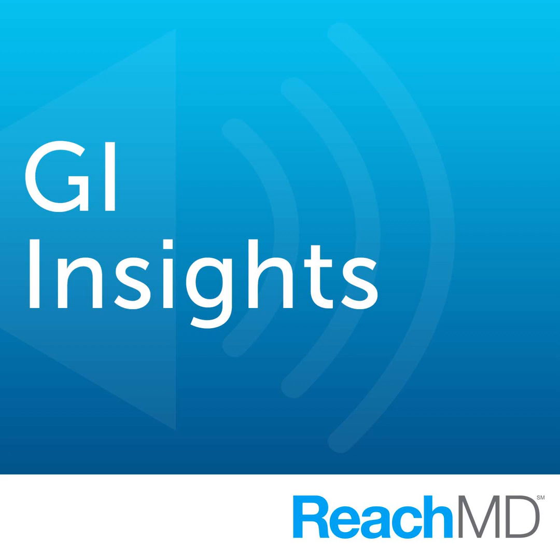And we're now even doing some creative things. We just published a case report where we used a handheld ultrasound probe that syncs to your digital device, like your mobile phone or your tablet. And we taught a non-medical patient to scan himself. He had severe colitis, put him on a new therapy. And after we gave him a simple lesson in the clinic, he went home and scanned himself with this handheld device every day and sent us screenshots of his bowel wall thickness.